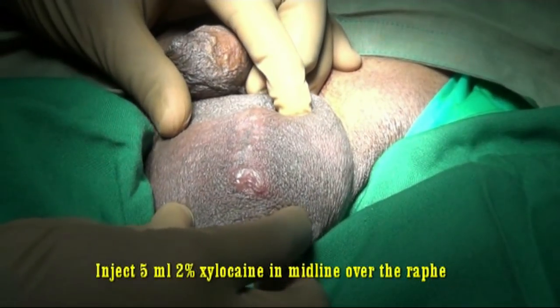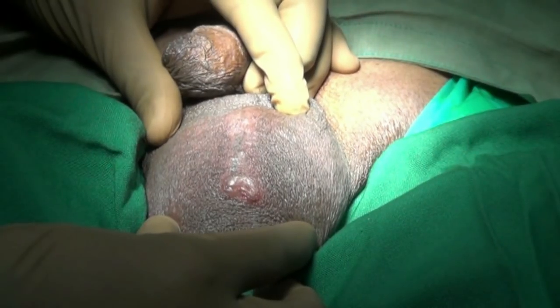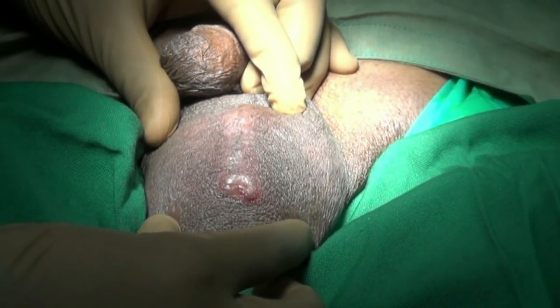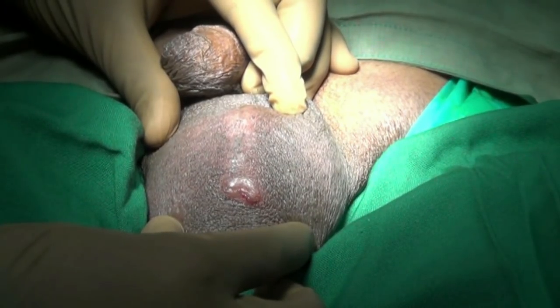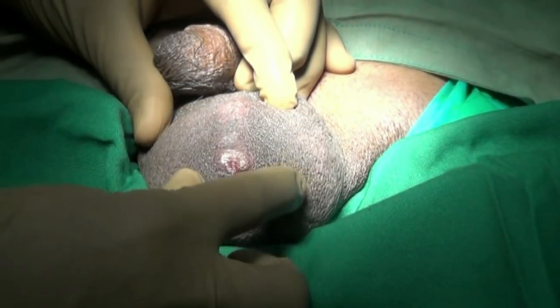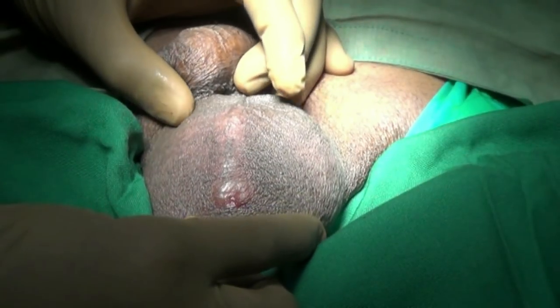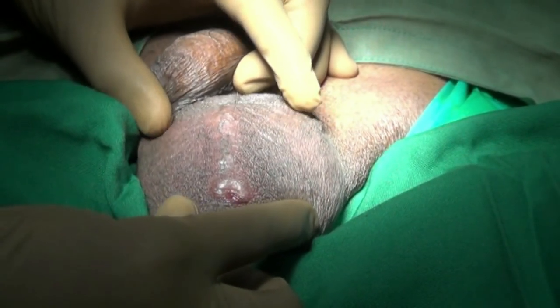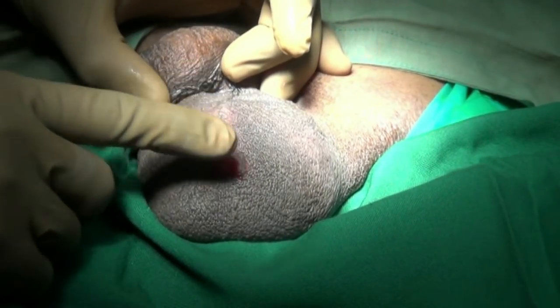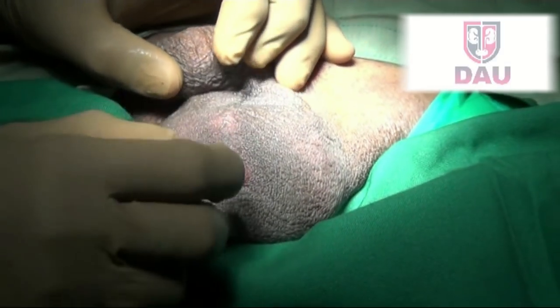I'd like you to have a look at the rugosity of the scrotal skin on either side of the raphe. As the lignocaine effect appears you will notice that this rugosity of the skin in the area of the raphe will disappear and this area will look a little more blanked out. When this gets blanked out and the rugosity is not seen, this means the effect of lignocaine has come.